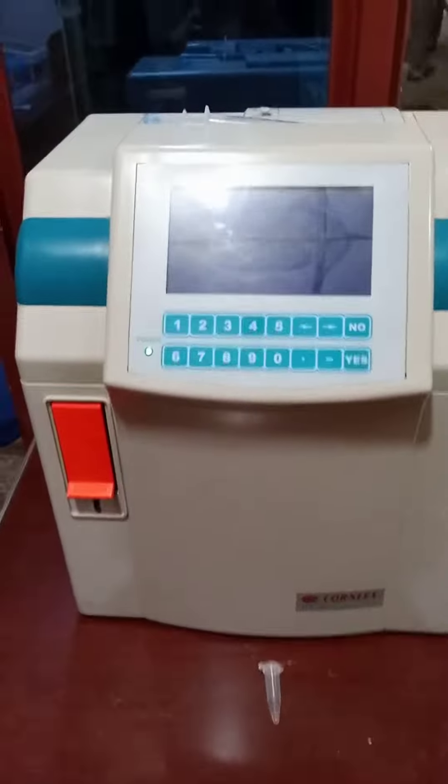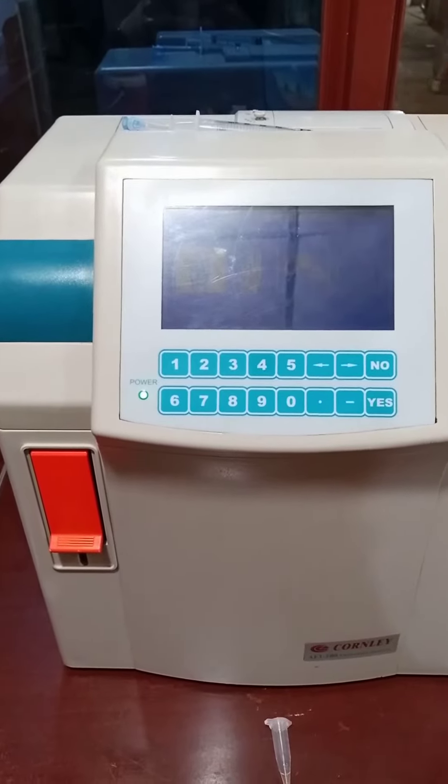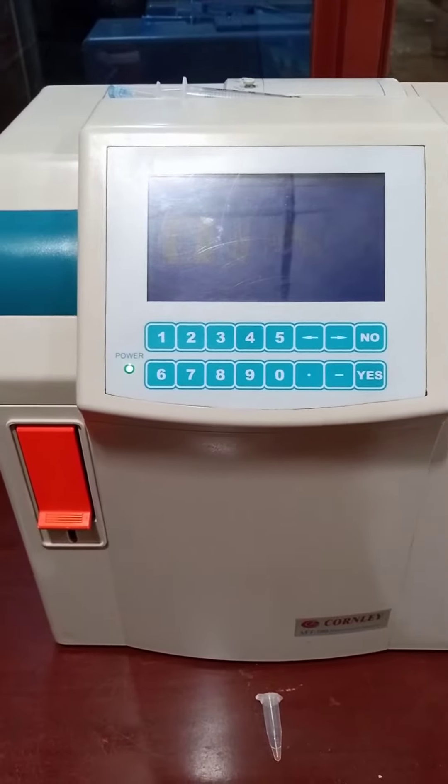The next machine is the electrolyte analyzer. This machine can analyze all the electrolytes in our body like sodium, potassium, chloride, calcium, and the pH of the blood.